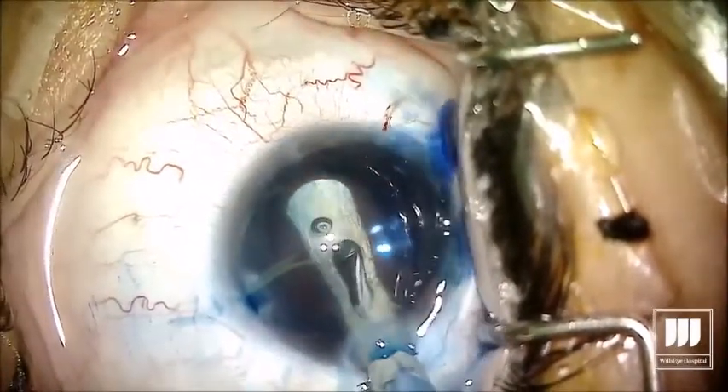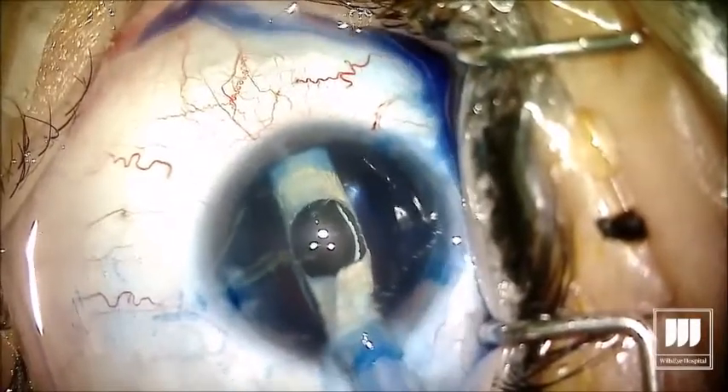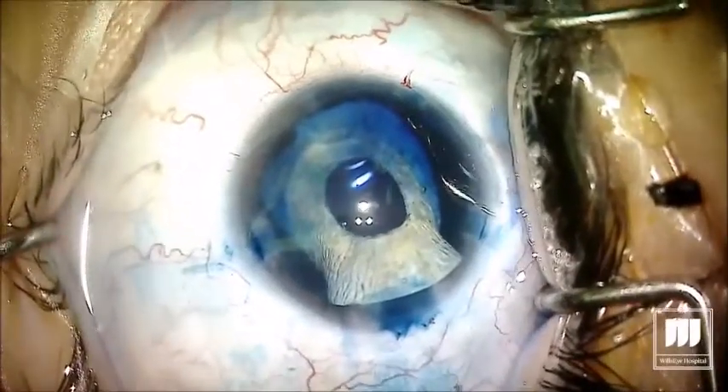That's our silicone iris prosthesis, trimmed down to about 9.5 millimeters. You can see in the video we're using a little intraocular ruler to measure the size of the capsular bag.